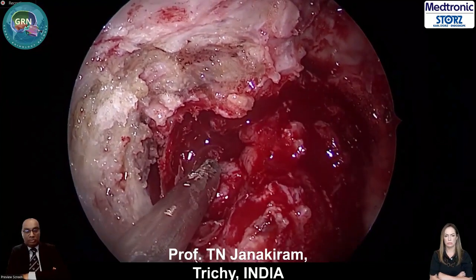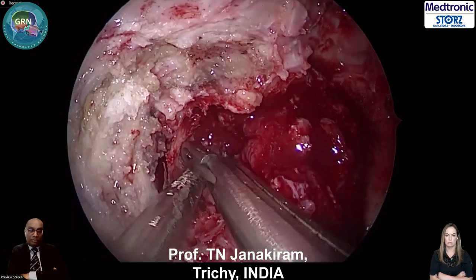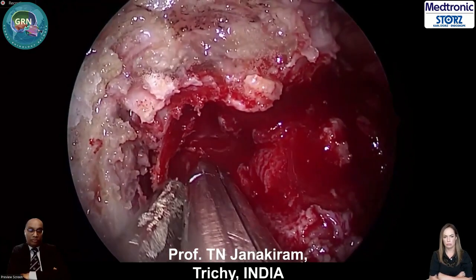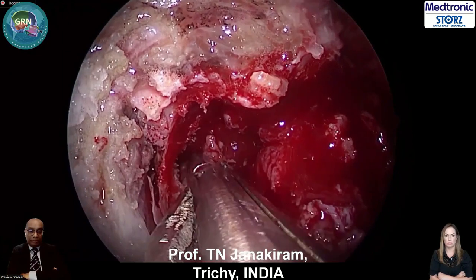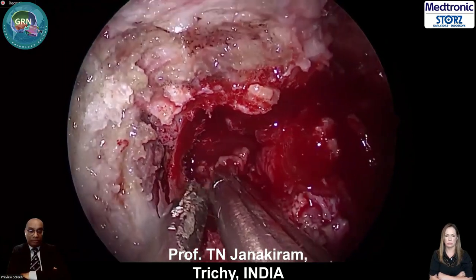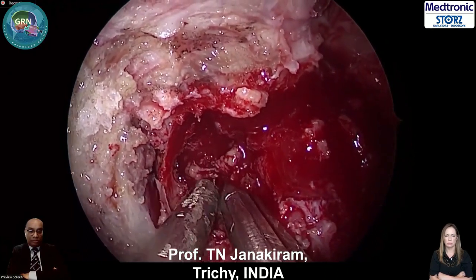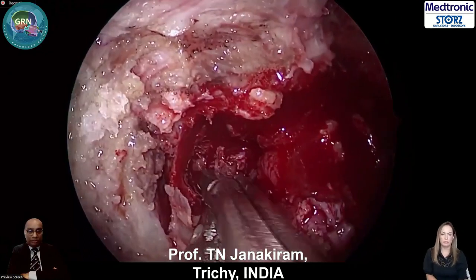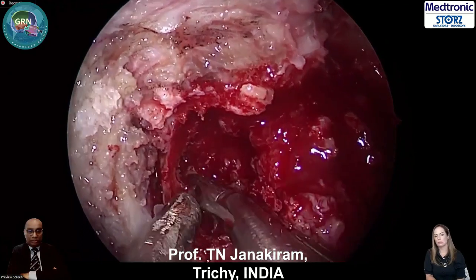I'll inform the anesthetist now that we are going for the tumor. So what do they prepare themselves for? This is all venous bleed. It's all pterygoid venous plexus bleed. See that? It's coming out of all the crevices of the bone. Can you see that clearly, please? Never ever use coagulation here. If you use that, you're going to leave behind recurrence.